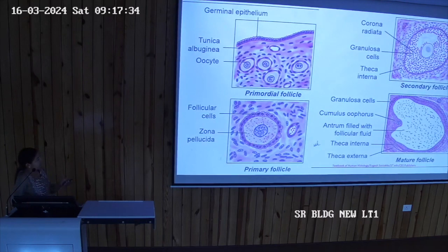So the primary follicle and the primordial follicle, we can differentiate here. These are small in size, these are larger in size. They are all at the same magnification, so you can differentiate the sizes of different follicles. So the primordial follicle is changing to primary. All the epithelium is going to the cuboidal side. So the squamous has changed to cuboidal, and these cells will become the granulosum layer, and these are now called the follicular cells. And this is the oocyte contained in the primary follicle.